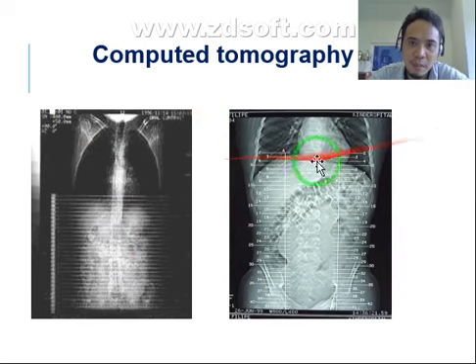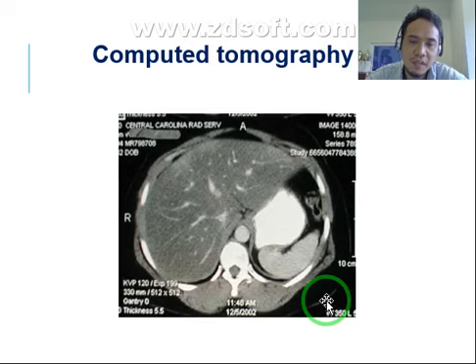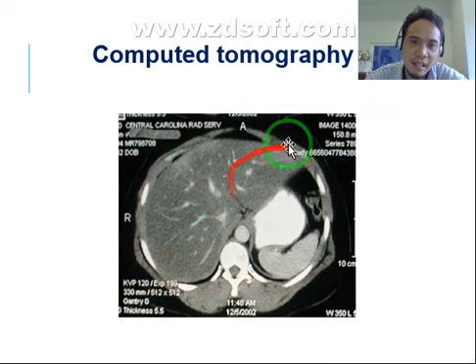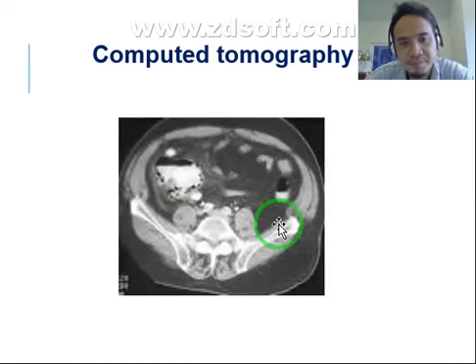So kung pwede, dili siya maputol sa diaphragm and makuha po pati ang pelvic area. Okay? So this is the mediastinal window of the abdomen. Okay, this is the soft tissue window of the abdomen. So, as you can see, makita niyo ang portal veins and the hepatic artery sa imong liver, okay, nga filled with contrast, and then the stomach also filled with contrast media.